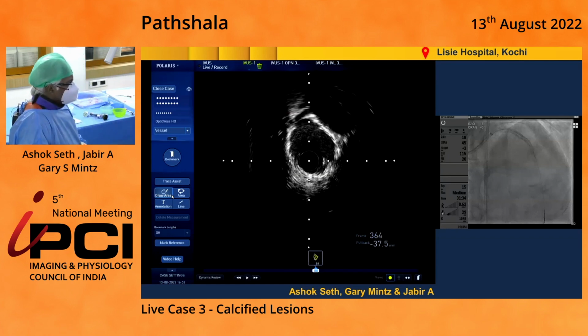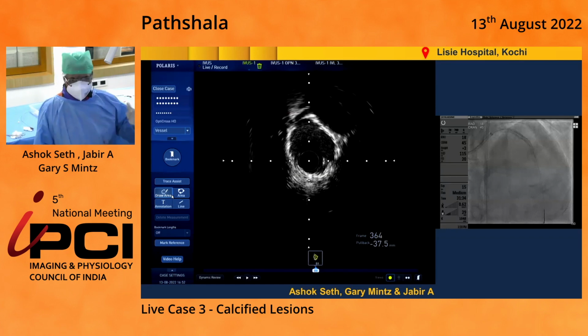But would you be stopping at this point after the next OPN? Because I think this is probably the best we're going to achieve in that area. For me, this is an antiplatelet and anticoagulant for 3 months because I don't know the mechanism of stent thrombosis. I stop the anticoagulant at 3 months when this is endothelialized. That's my strategy. This is a pharmacotherapy case now.